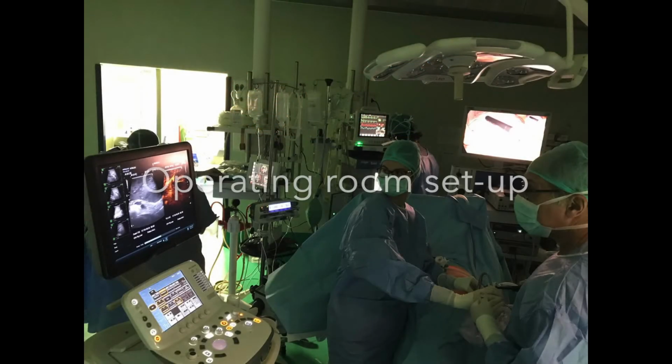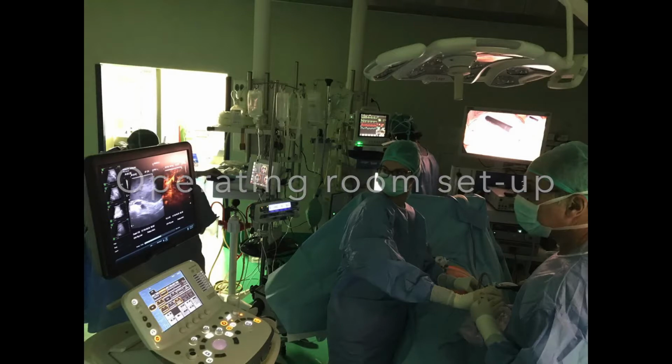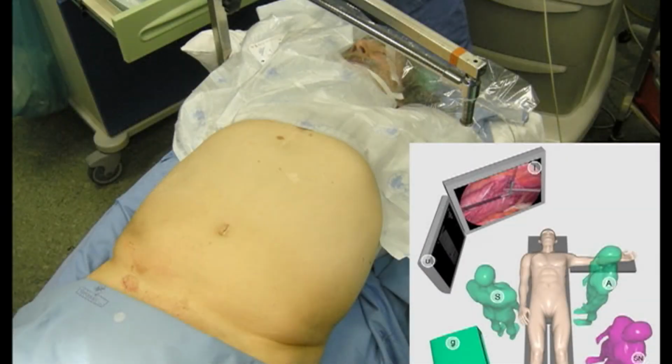The first step is the setup of a operating room requiring adequate laparoscopic and ultrasound equipment. Patients with lesions not visible at percutaneous ultrasound, which are located deeply in the liver dome and in the 7 segment, require different positioning. Generally, the position of the patient is supine on the operating table with the left arm extended.